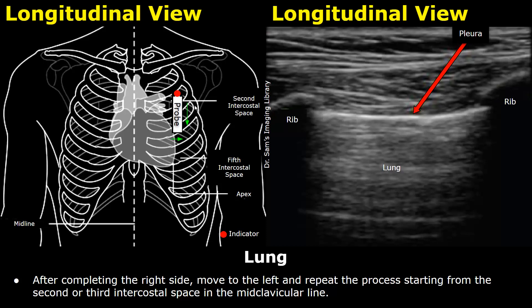After completing the right side, move on to the left side and repeat the scan in a similar manner. Start by placing the probe in a longitudinal view at the second or third intercostal space in the mid-clavicular line, then move downwards and laterally to scan the rest of the intercostal spaces.